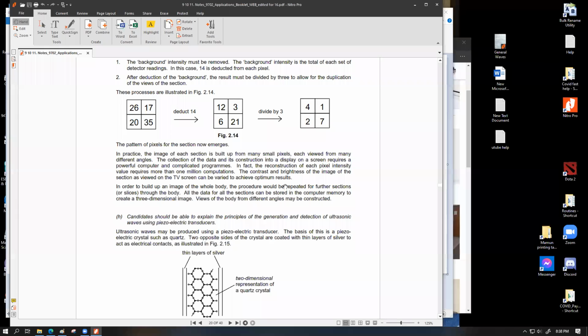Which leads me to the other part that I actually derailed from while I was talking: we know how different locations of the human body should have values. How does the lining of a stomach look? How should that continuous data stream appear to be the stomach? How does the whole intestine look, or how does the liver look, or how should different parts of the liver look?